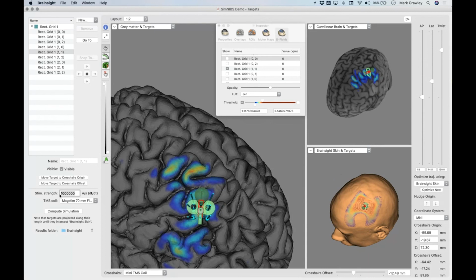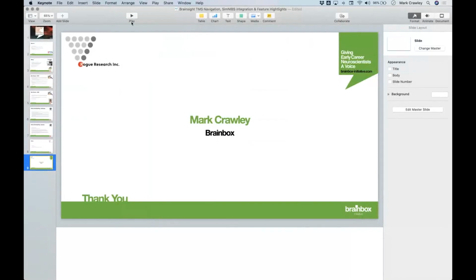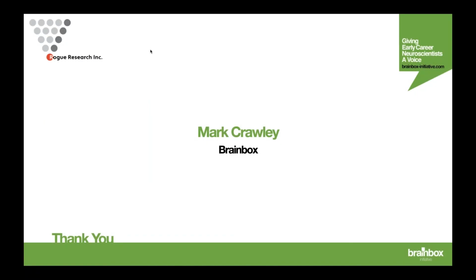And then I think that wraps up all the questions. Rock has pointed out, on the technical side of what the computer has, that SimNIBS can use multiple CPU cores. So the more cores and the most RAM you can afford, 32 GB is good, and that would speed things up. Cool. Thank you, Rock.